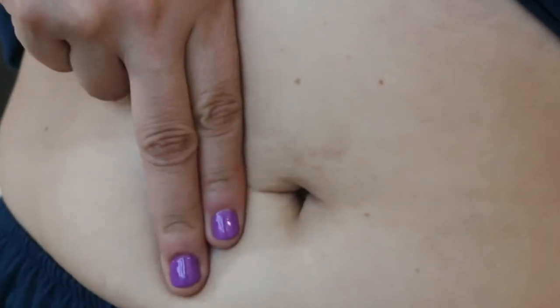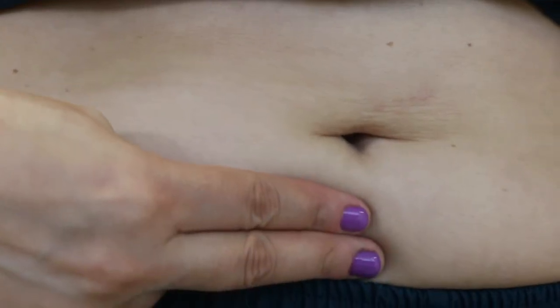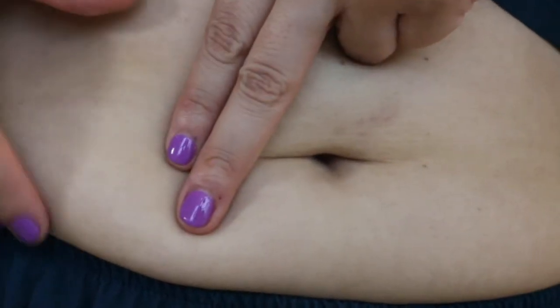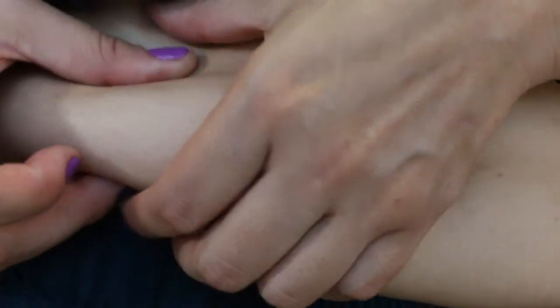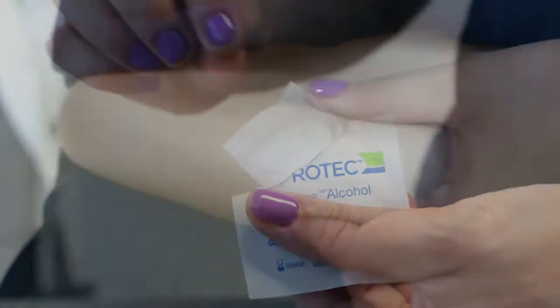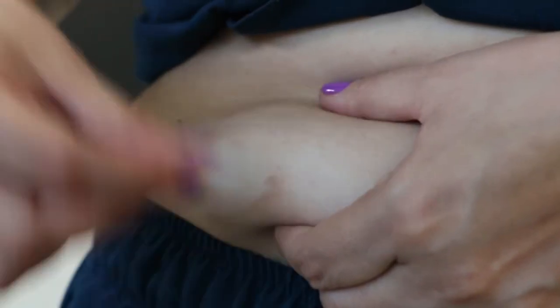The abdomen is the area of application. We will take the navel as a reference point and the medication will be injected two fingers of lateral, upper, or lower distance. After choosing the area of application, clean the area with an alcohol swab. Remember to clean with gentle movements and do not pass the swab more than once in the area that has already been cleaned.